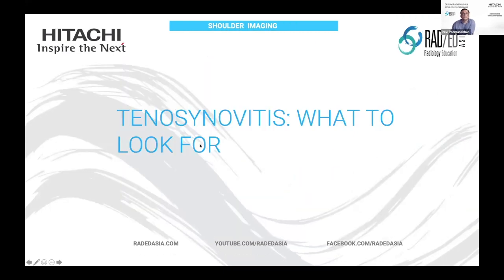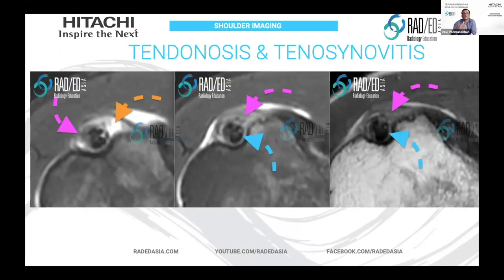So what about tenosynovitis? We said that it's normal to have a little bit of joint fluid. Tenosynovitis can be uncomplicated in the sense that there's just more fluid in the biceps tendon sheath, or you can actually get inflammatory changes and actual synovitis where we get altered signals. The orange arrow is pointing to normal signal within the biceps tendon sheath — it should be bright.